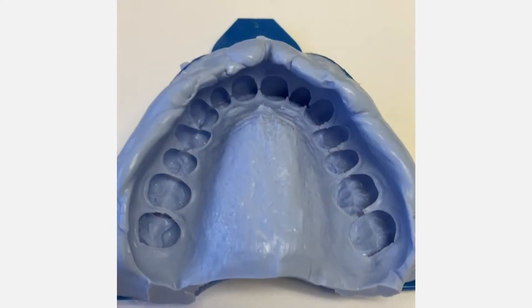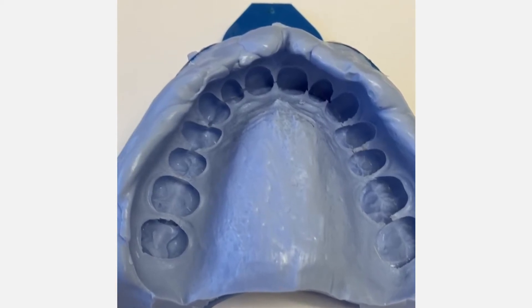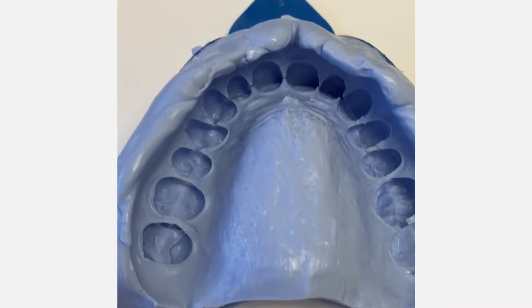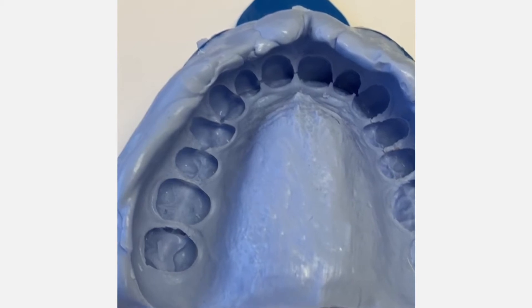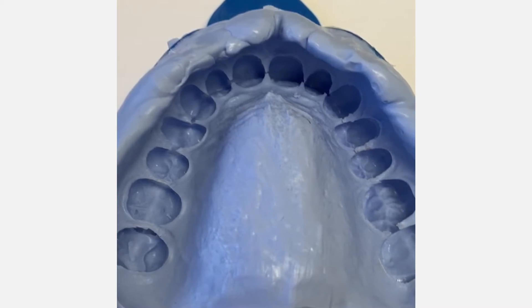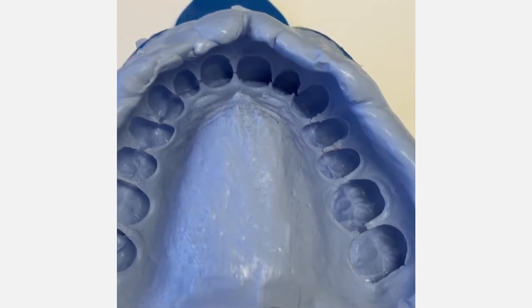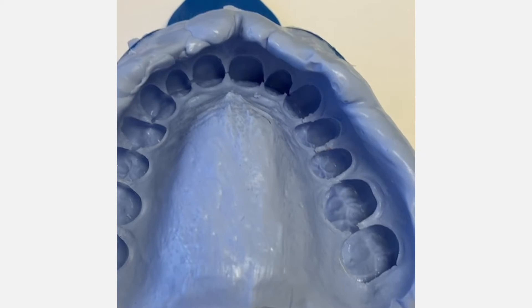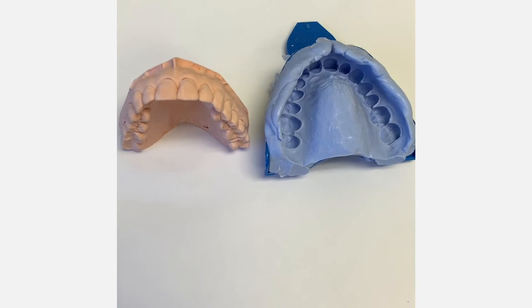Now let's take a look at the impression I took after I relined it. Look at the sharp detail of this impression — no flaws anywhere, it's just really crisp and detailed. We got everything that we needed. That's the beautiful thing about this impression material, Status Blue by DMG — it allows you to reline your own impression and capture all the detail you need. I also poured up this impression so let's look at our model.